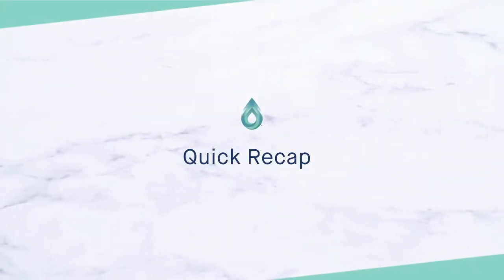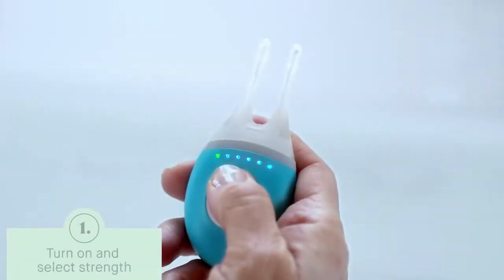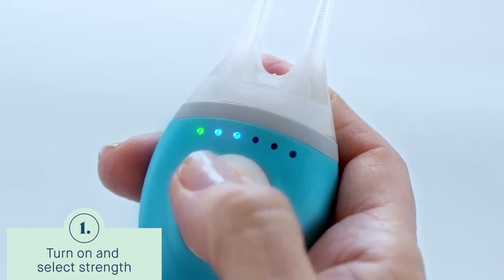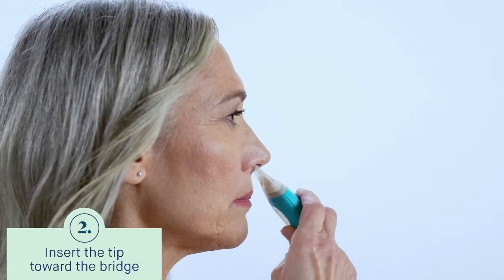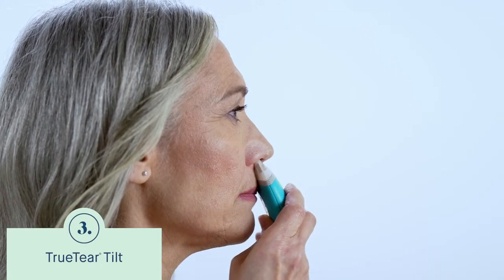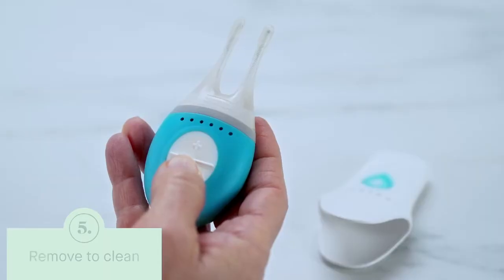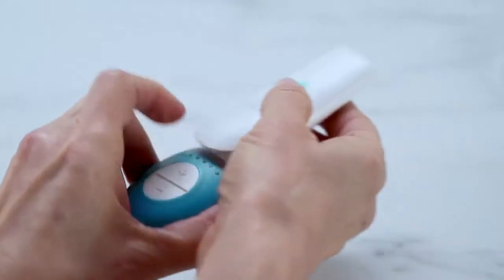As you get comfortable using TrueTear on your own, refer to this quick recap: Turn on the base unit and select your preferred strength level. Insert the tip toward the bridge of your nose. TrueTear Tilt. Hold until tears pool. Remove to clean. And you're done!